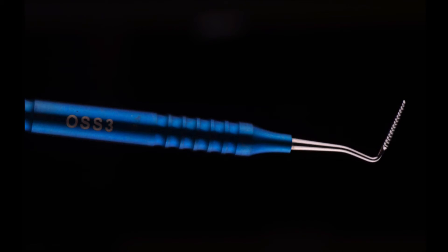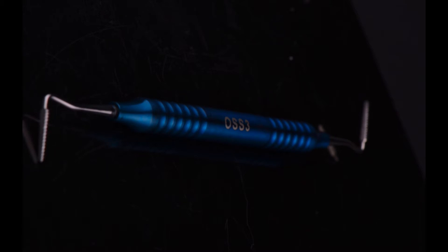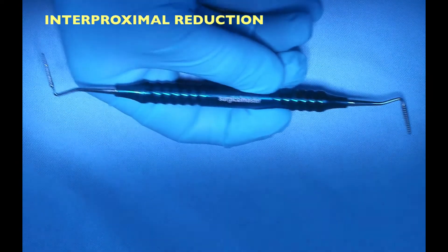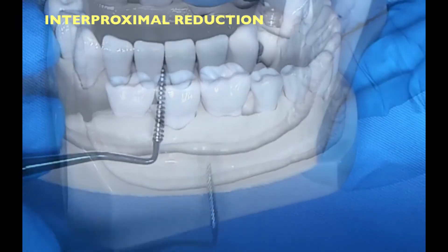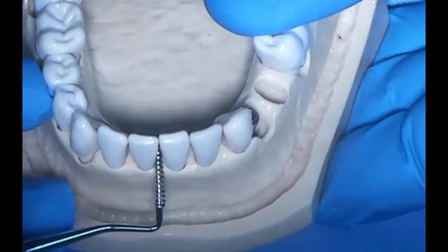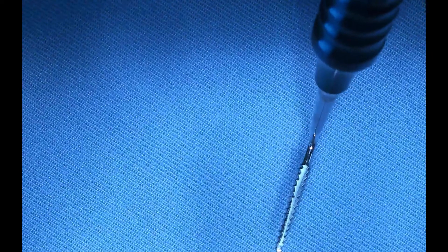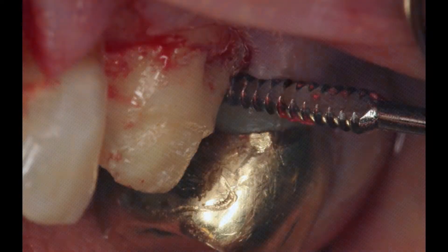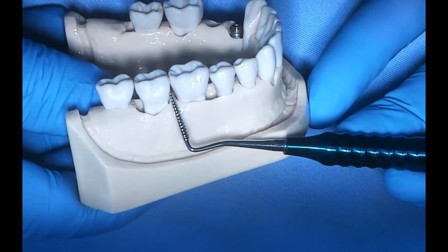The third instrument is a file — an interproximal file, or a Sugarman file — and it's meant for interproximal reduction. For example, in functional crown lengthening when we need to reduce bone circumferentially in between teeth where there's a contact. You can reduce bone carefully in between teeth, and a great feature of this tool is that it has a flat side. The flat side faces the tooth, so when you're reducing bone, you're not damaging the adjacent tooth. You can use this tool in an in-and-out motion in between the teeth.